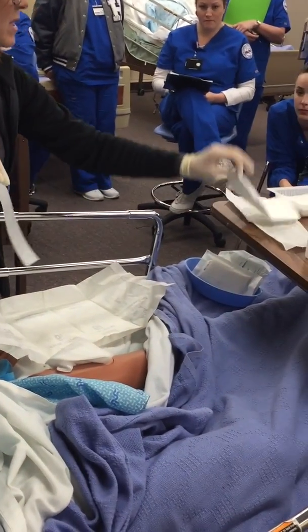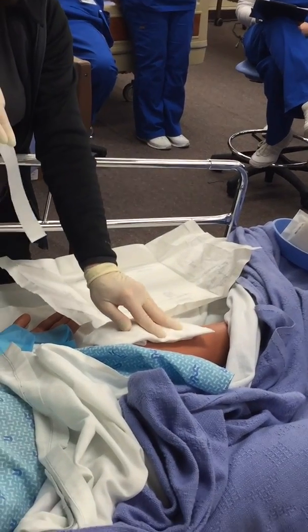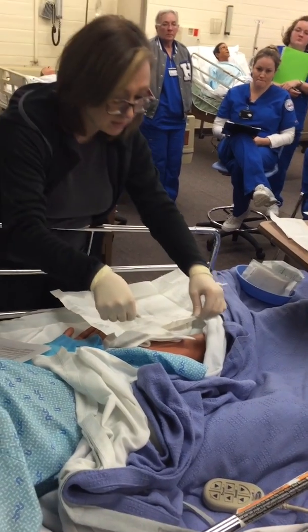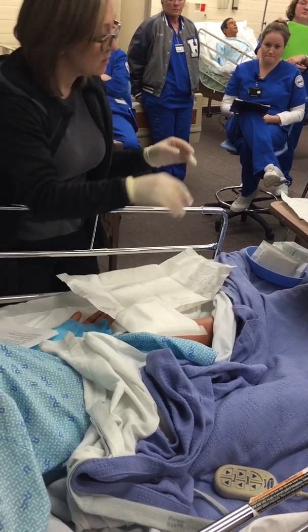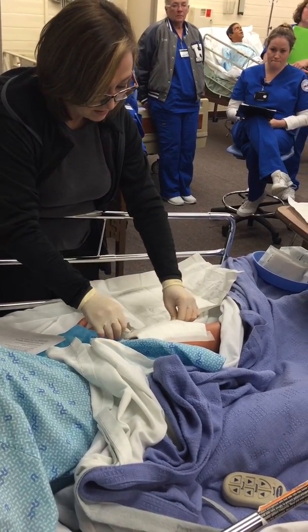And then the ABD goes straight over. And that goes right on there. And now you don't have to be sterile because the wound's covered. Then I'm going to put my tape in place. And it should only be on the edges. You don't have to put 27 rolls of tape on your patients, guys. Just cover the edges up.